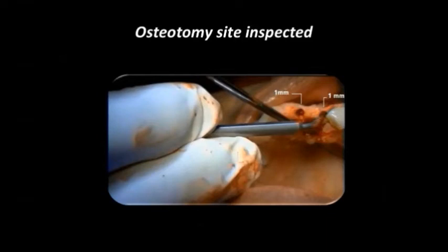As you can see, we have a very thin bone on the buccal side in the 2 implant area. I am checking to make sure that I am reaching the proper depth. I am not perforating, or if I'm perforating, where do I perforate, and how do I cover it. All the things you have to do in general when you place an implant.